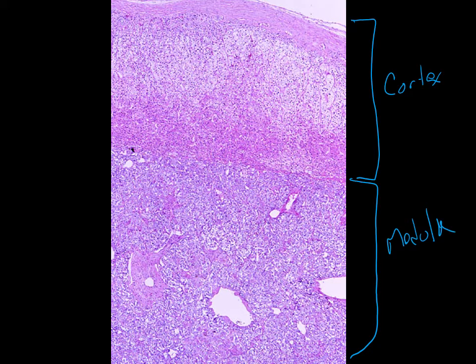And within those two, we can see that the medulla is basically all of the same tissue when we look at it. And so in a sense, we kind of have the same structures all throughout the medulla itself. And it looks pretty much consistent from top to bottom through that medulla.